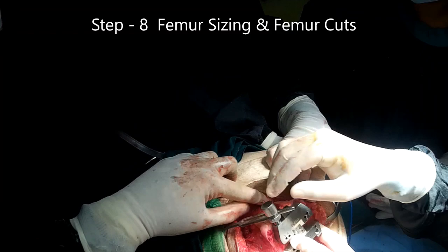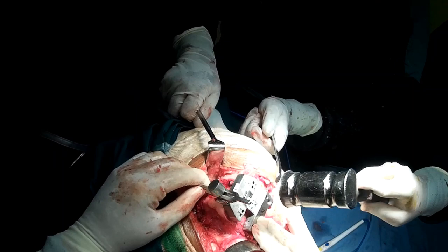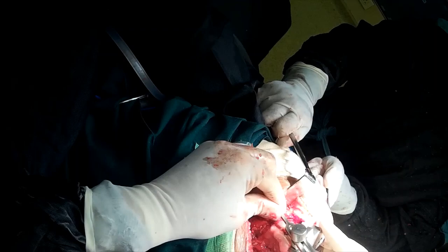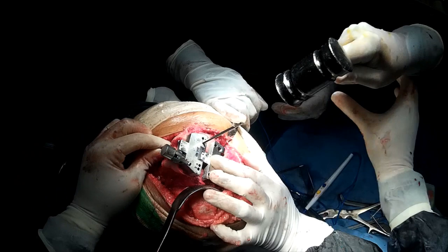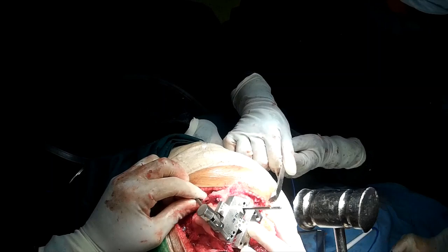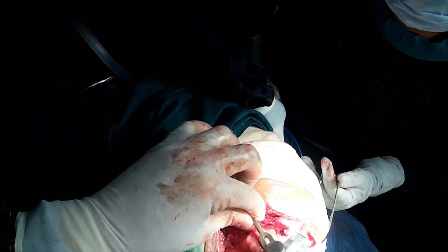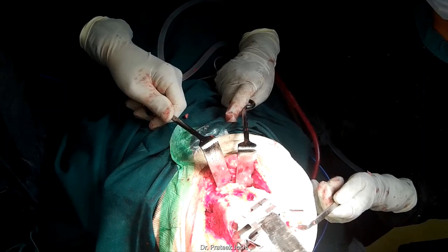Now femoral anteroposterior sizing guide is secured over the distal femur with 3-degree external rotation. Cutting block is applied over the headless pins, centering the block on the medial lateral dimension of the femur.